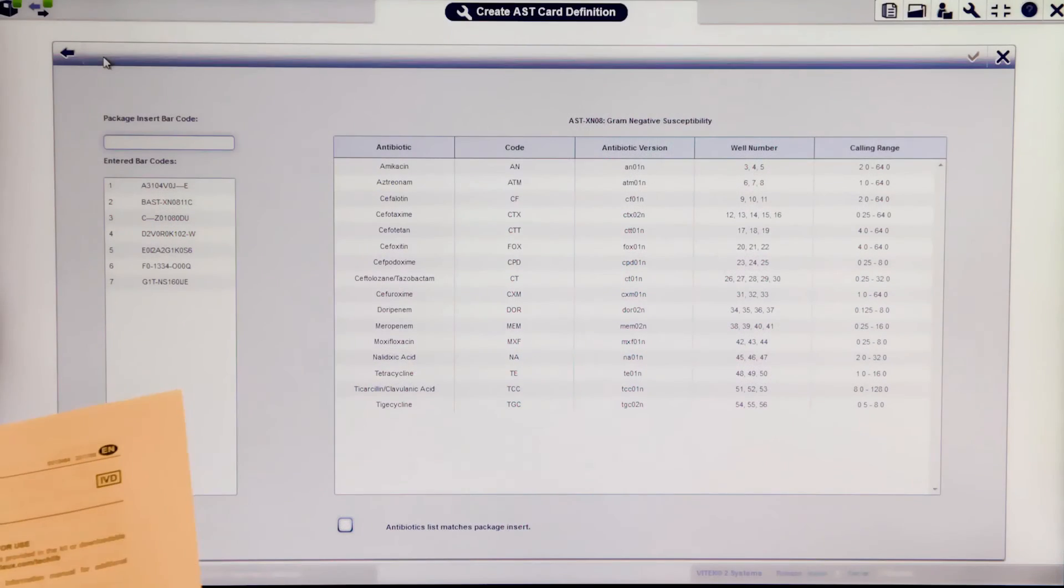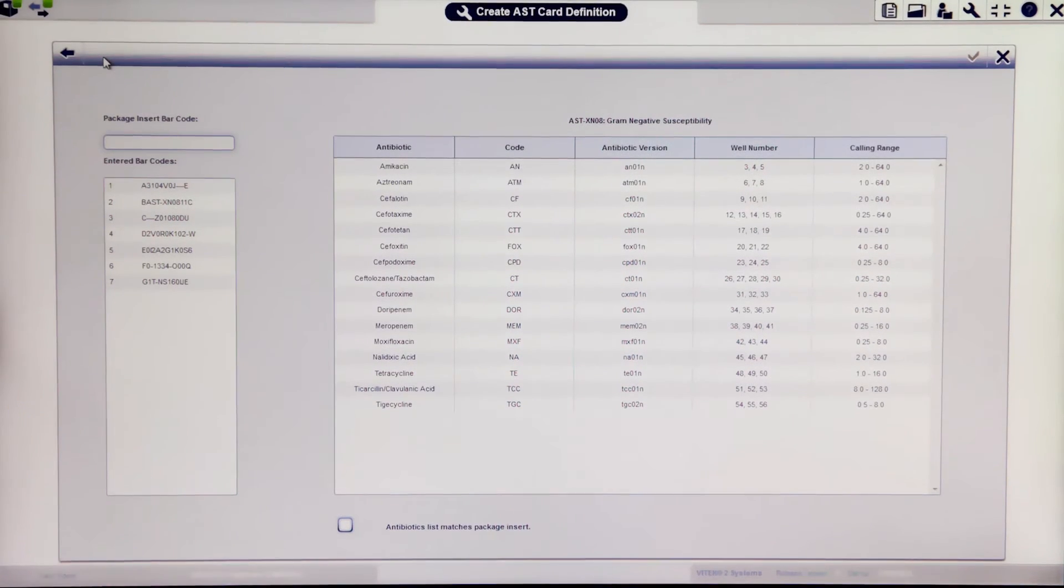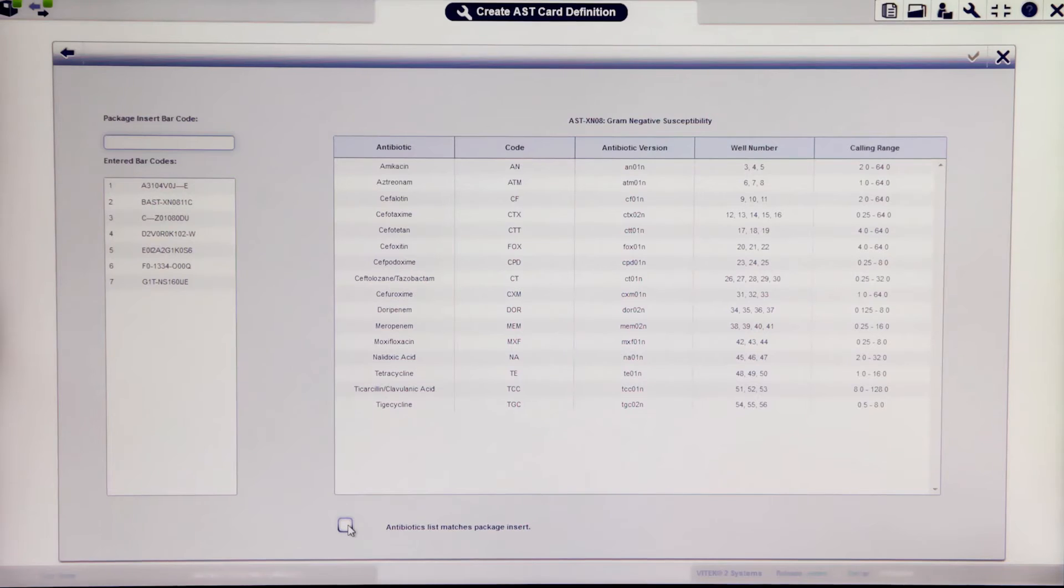Confirm that the list of drugs on the card matches what is on the package insert and select the checkbox confirming this.